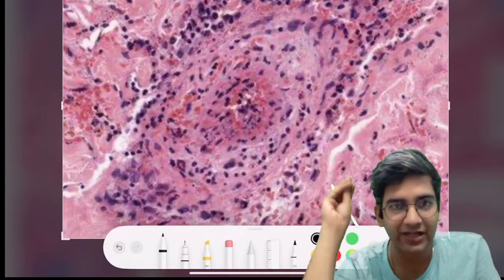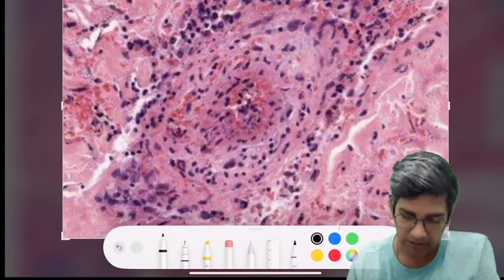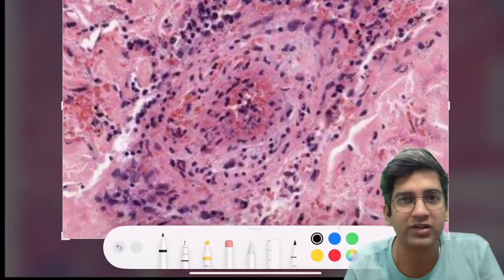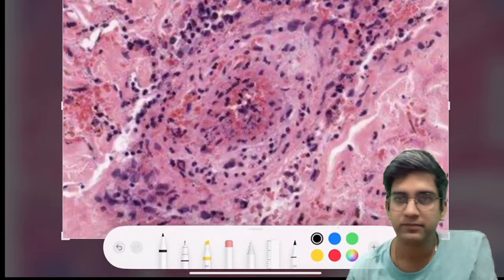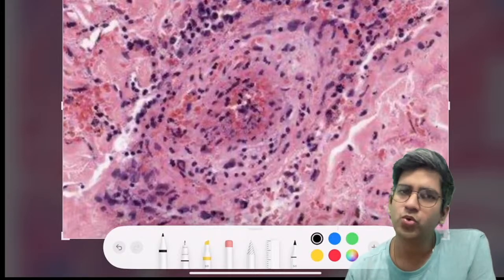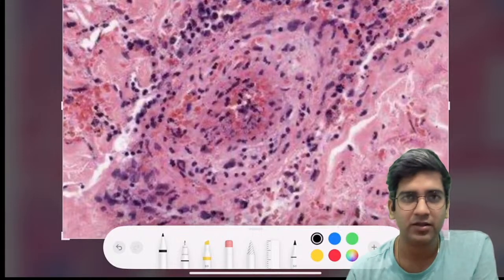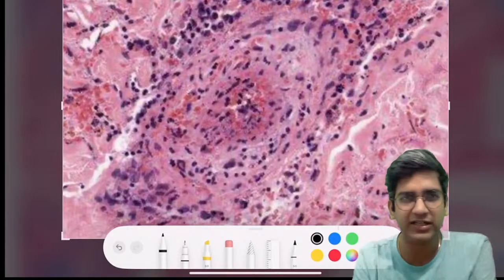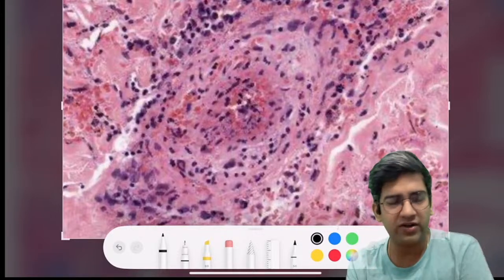I've taken a screenshot and zoomed into that particular vessel. Fine. Okay. Tell me what you're seeing in this vessel. Whatever comes to your mind, tell me what you're seeing in this vessel. Perfect. What is seen in this vessel? You must have seen a normal dermal vessel or a vessel in any normal biopsy, maybe in a breast biopsy or a colonic lesion, right? You must have definitely seen that. What do you think is abnormal in the vessel? Hakim is right. One is the lymphocytic infiltration.